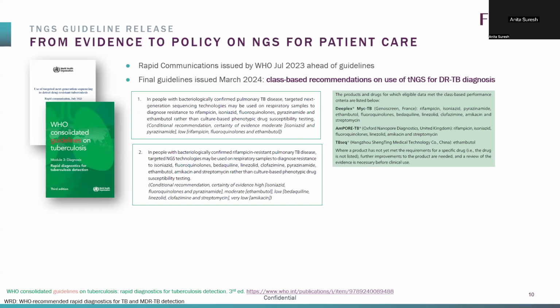You'll see the final guidelines gave a class-based recommendation to use targeted sequencing for DRTB diagnosis in two cases in terms of the populations you could use it in.